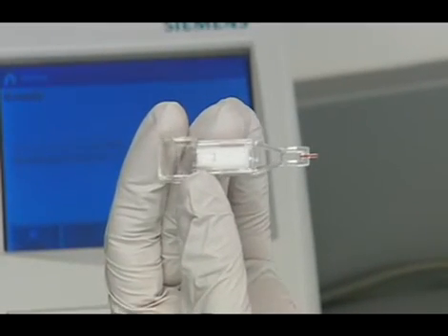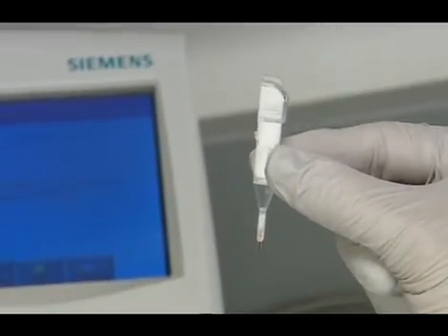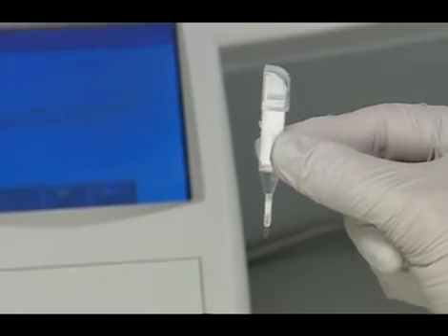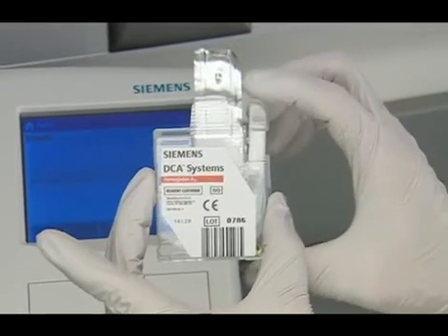You will need to insert the capillary holder into the reagent cartridge within 5 minutes of collection. Carefully insert the capillary holder into the reagent cartridge until the holder gently snaps into place.